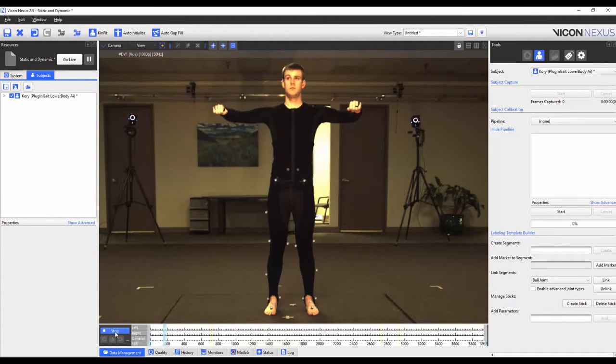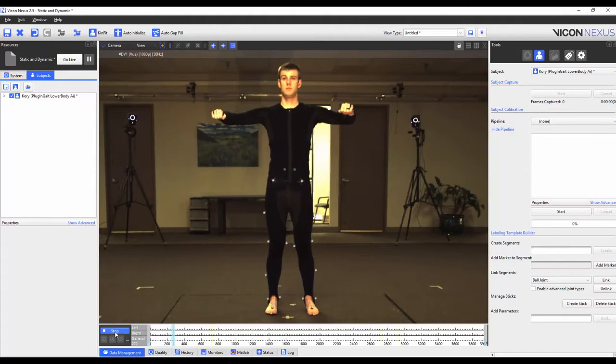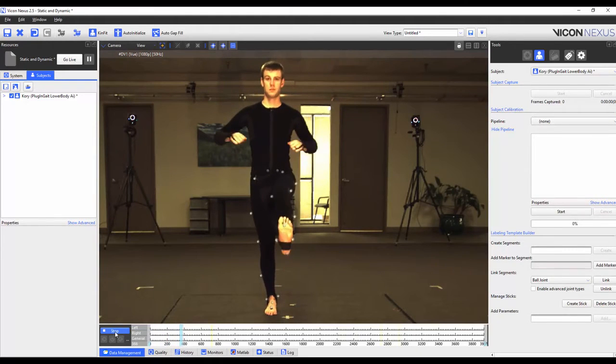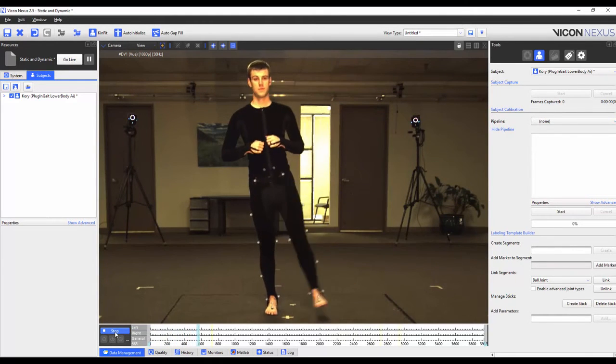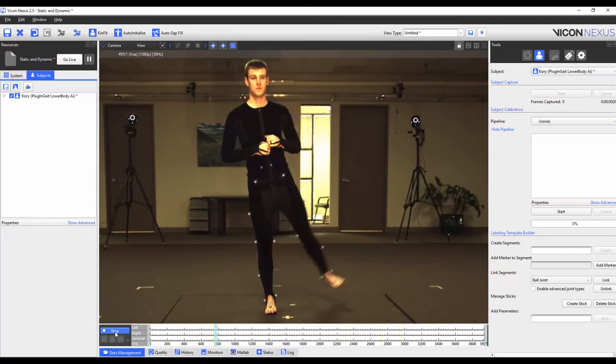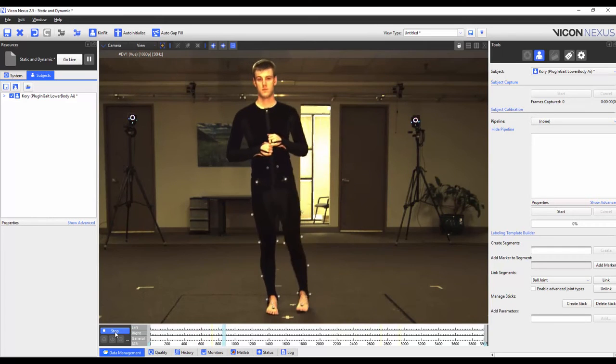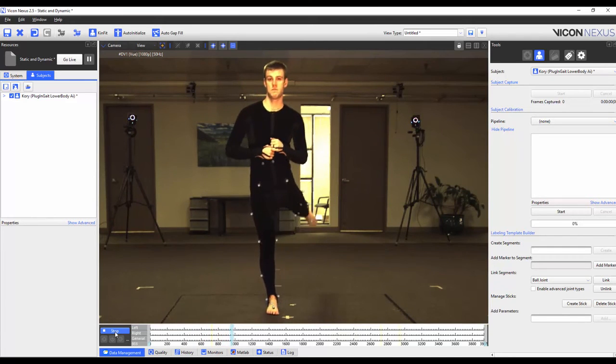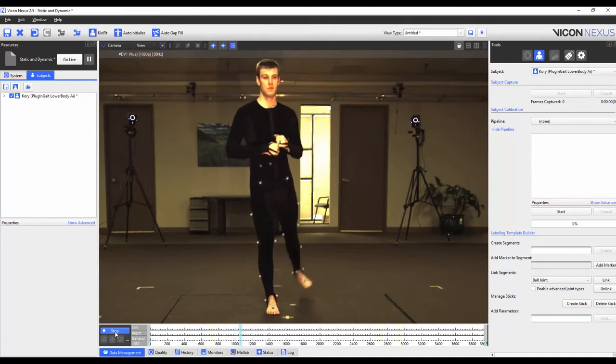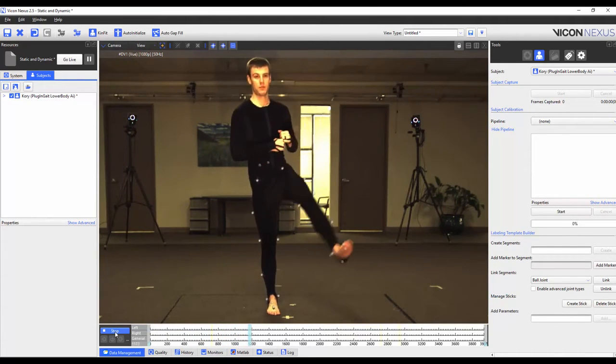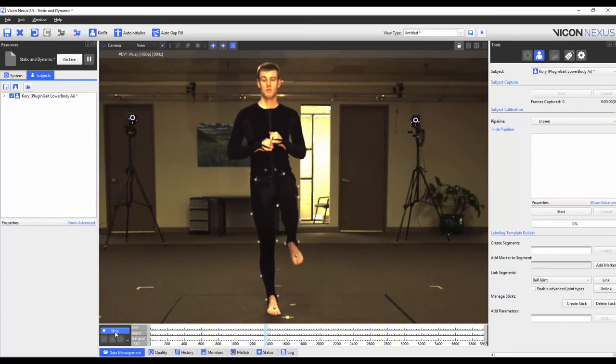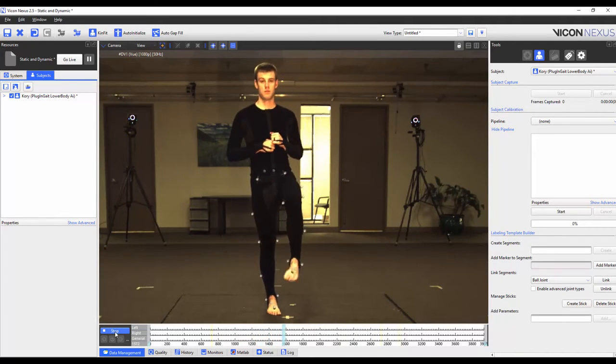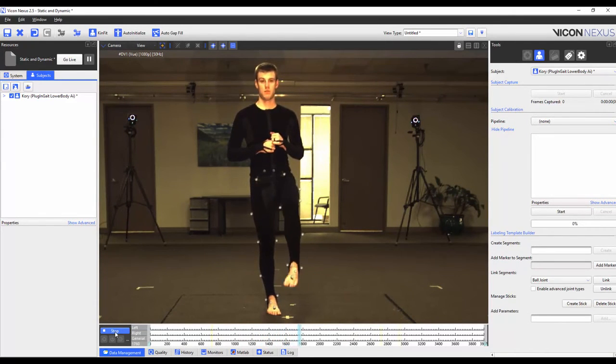I've captured a trial where my subject starts off in the base pose and then goes through the range of motion for each joint where the subject performs the star pattern for the hip, flexes and extends the knee and rotates the ankle joint.